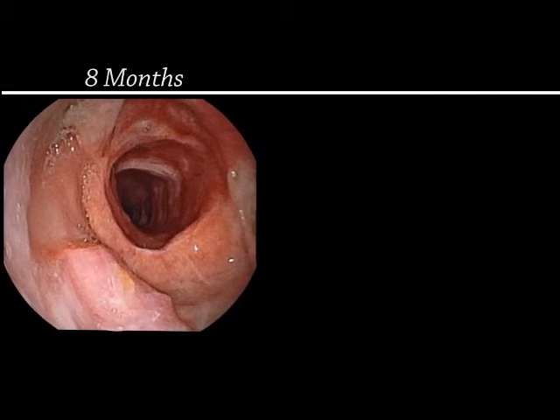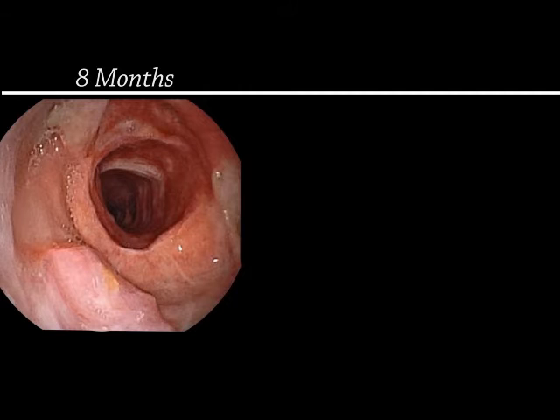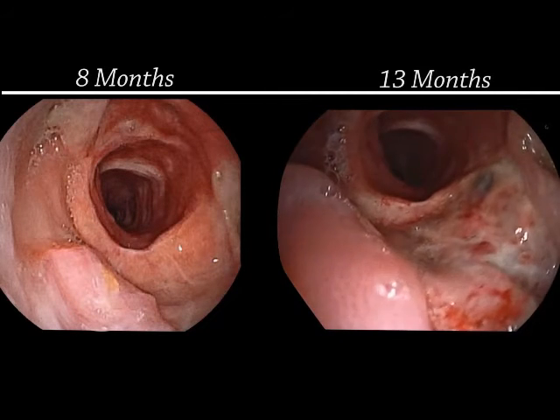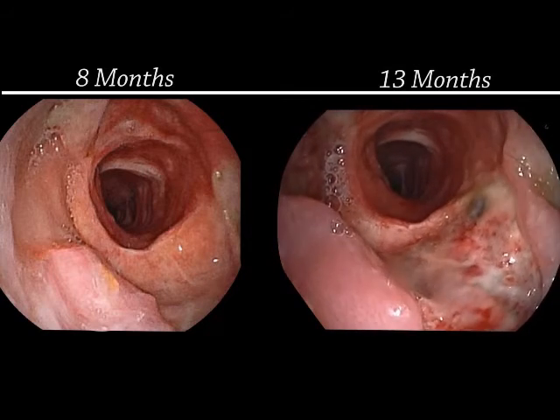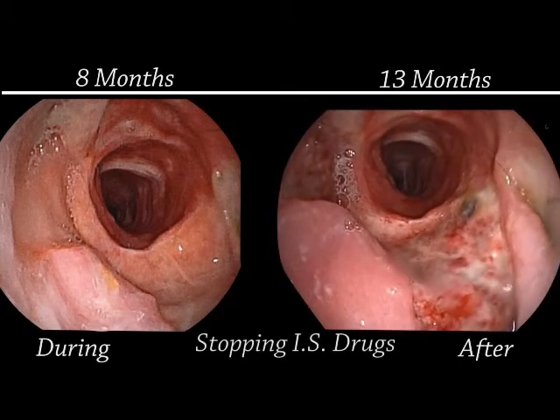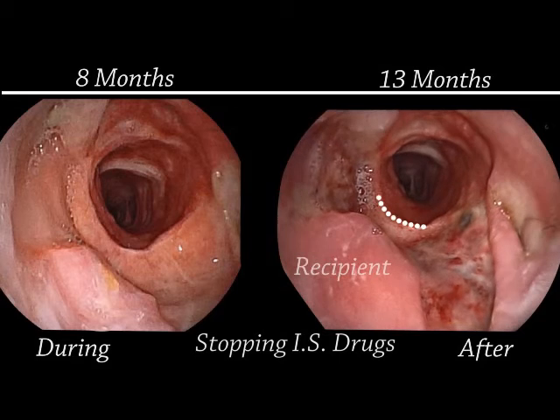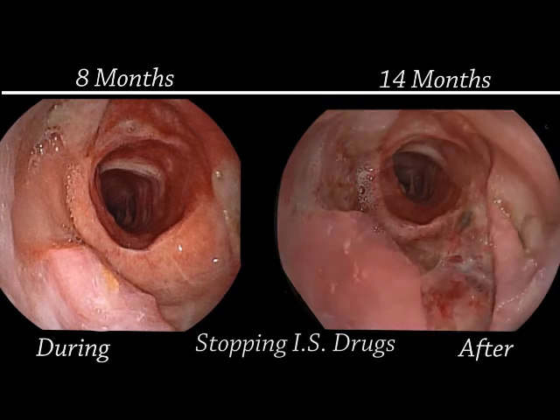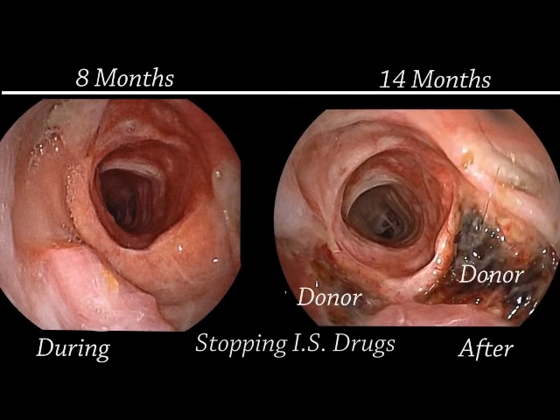The endoscopic image 8 months after orthotopic transplantation is now compared with that after 13 months, 1 month after stopping immunosuppressive drugs. After 13 months, the recipient's buccal mucosa is intact and swollen, while the donor's epithelial lining shows early signs of necrosis. At 14 months, necrosis of the donor's epithelial lining is more advanced.